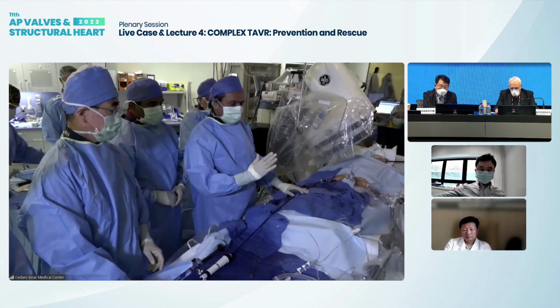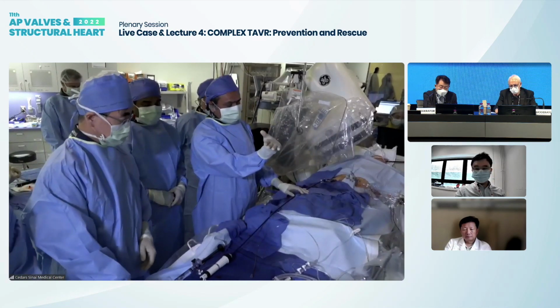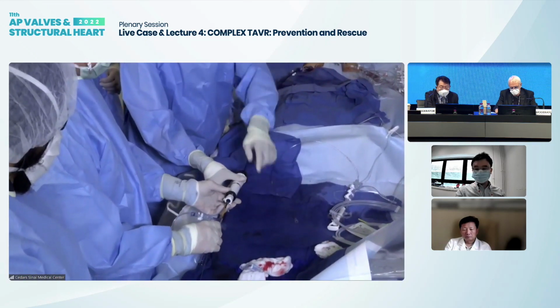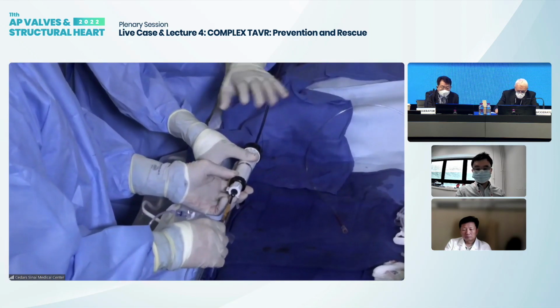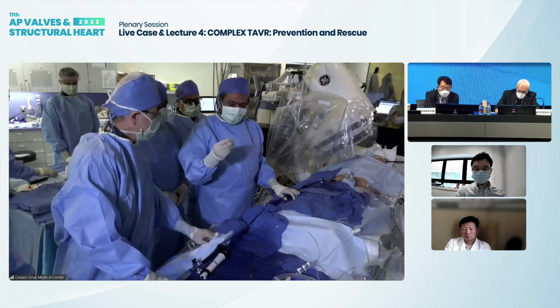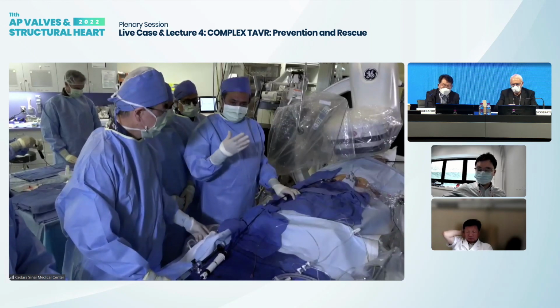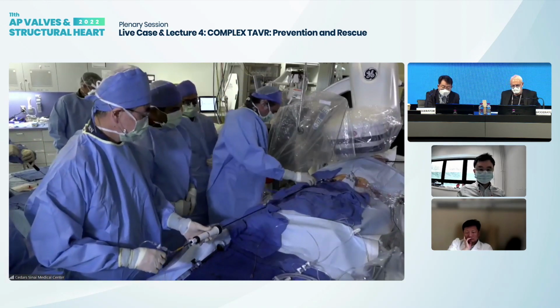Now, what we want to do is the opposite. We want to make a retroflexion on the right side into the left atrium. So the Edwards logo is not up, it's actually down, as we advance and spin the retroflexion wheel. That's an important thing to remember. Also remember that you have mounted the valve in a different way, not the way you would do the usual retrograde transfemoral TAVR procedure. Those are two very important things to remember.